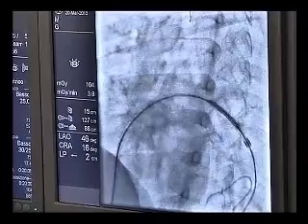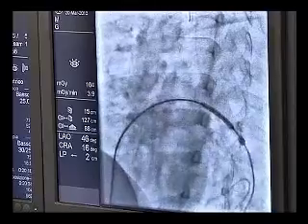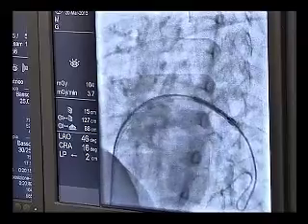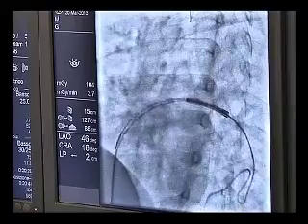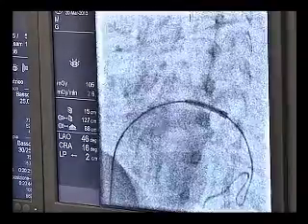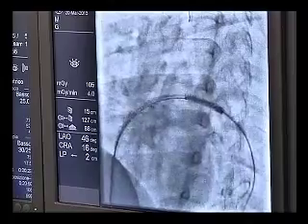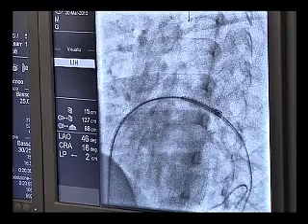And to do this, we use control angiographies just to put the stent in position. The position should be good now, and we will check by repeat angios. Can you show us any selected picture to show us where the sites are of this pulmonary?